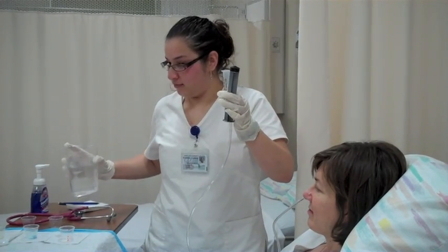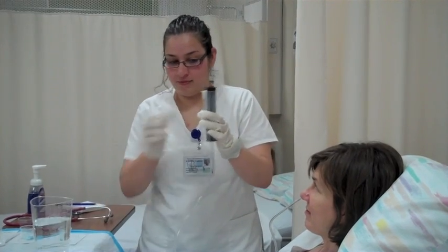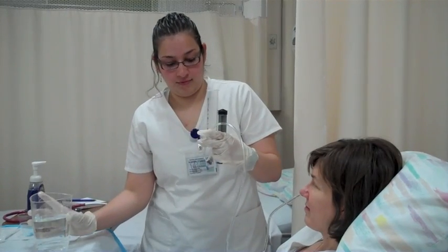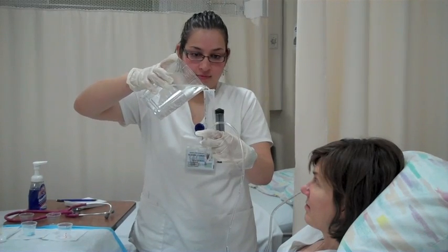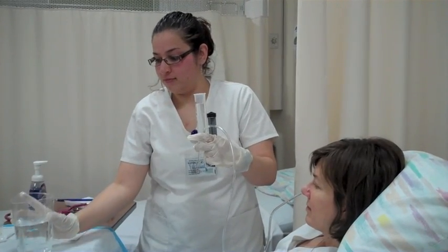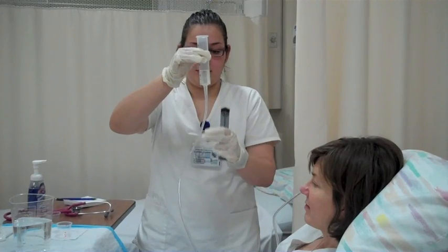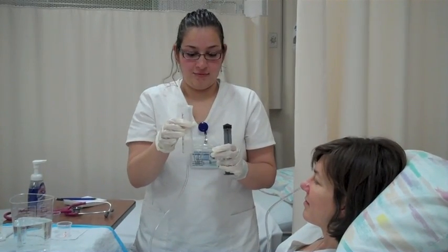Follow the last dose of medication with a 60 milliliter water flush. First, reclamp the tube. Pour 60 milliliters of water into the syringe. Unclamp the tube and allow the water to enter the stomach. This ensures that medication is not left in the tubing.